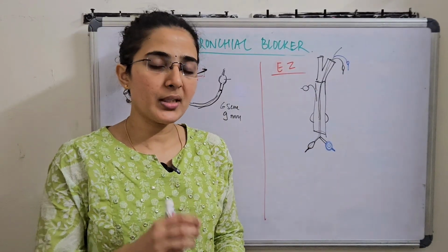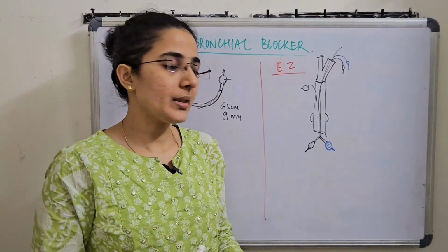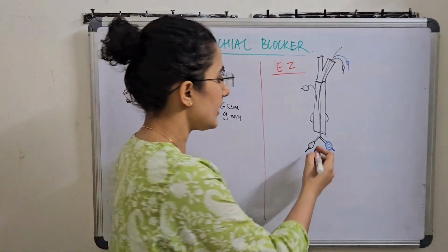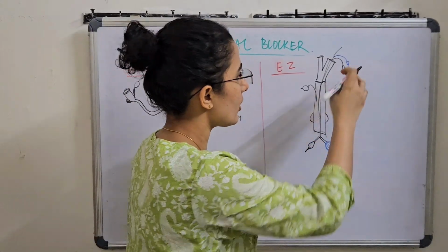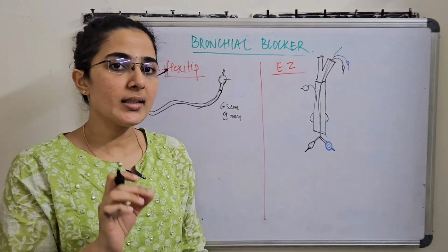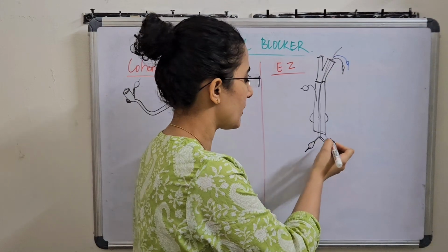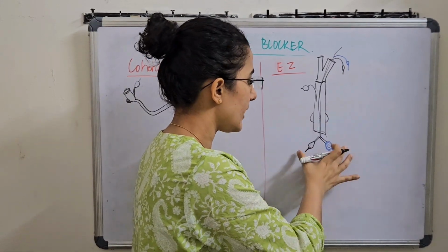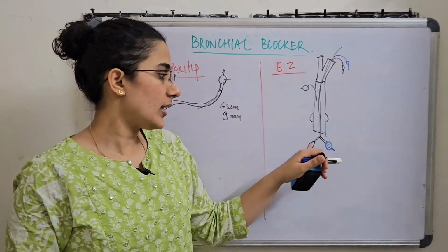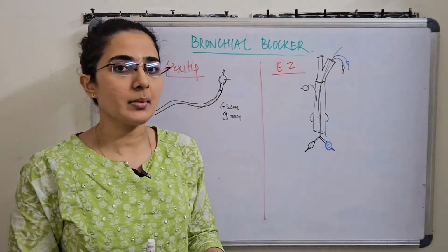Once we put the patient on a single lumen endotracheal tube, we ventilate the patient. Then under bronchoscopic guidance, we can put the EZ blocker in place till we reach the carina. With this Y shape, we have to ensure which side we are putting which colored inflation tube, and on which side the inflation balloon is present. Usually an EZ blocker contains two differently colored balloons, one blue and the other yellow, and same colored pilot balloons with inflation lines are present.